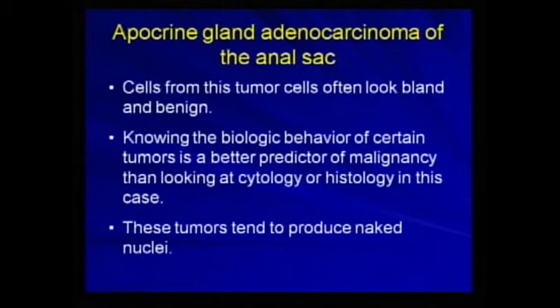One of the tricks on this particular neoplasm is that the cells look quite benign. They also have very small nuclei. You don't see the bizarre features of malignancy you will see with other carcinomas, but they also don't have that hepatoid or that liver look to them. You tend to see acini if you're lucky in this.